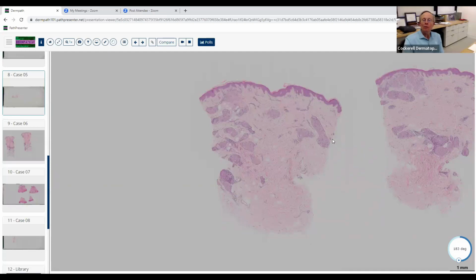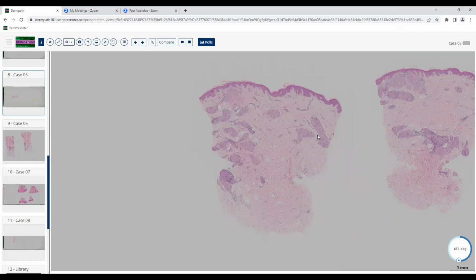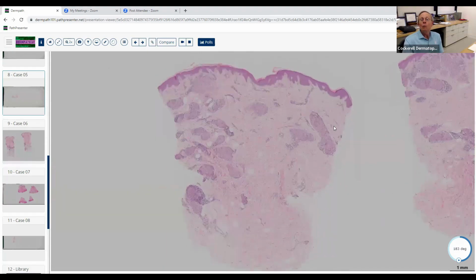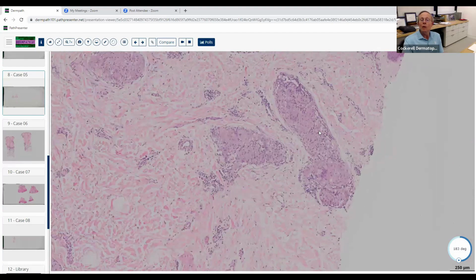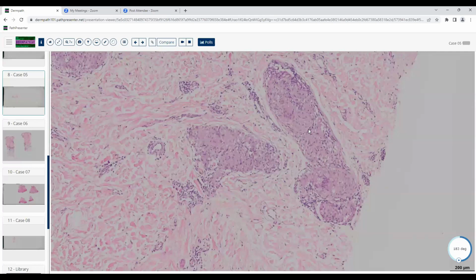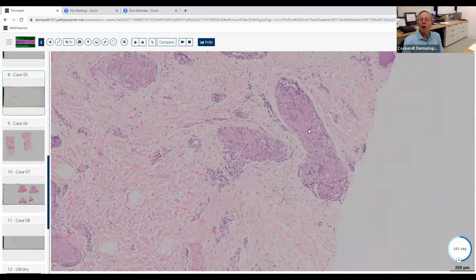Okay, so what's the pattern that we would call this? Granulomatous. It is granulomatous. You said nodules, so it's a nodular dermatitis, right? All nodules diffusely. Yes. And then you said quite correctly that they were nodules of histiocytes. Okay, what gives you a nodular dermatitis with no involvement of the epidermis with histiocytes here? What's the most likely diagnosis? It could be sarcoid. Yeah, that's the most likely diagnosis by far.